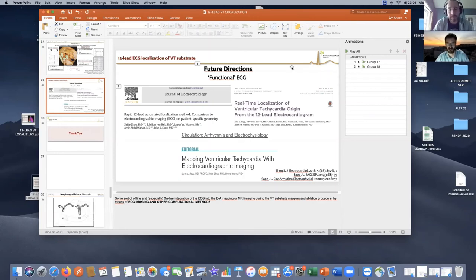Maybe we move to the other extreme of the diagnostic assessment. Right. One of the things I've always liked about the ECG criteria, which we use in the lab, not just for localization but also to have some idea of scar substrate, is the cost effectiveness and the availability. Everyone has access to the ECG, and in many labs around the world, the imaging resources are expensive and not always available, especially MRI and PET CT. So in your practice, with your patients, how much stock do you put on the ECG when you take someone to the lab, and how much do you rely on additional imaging techniques?